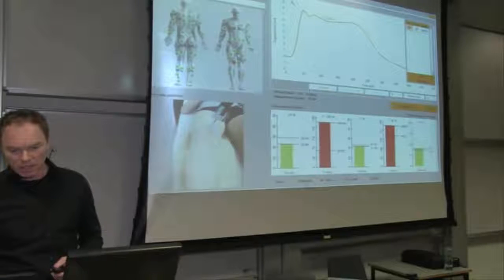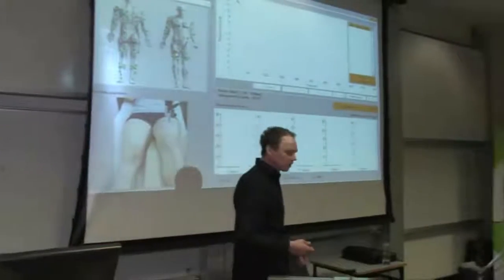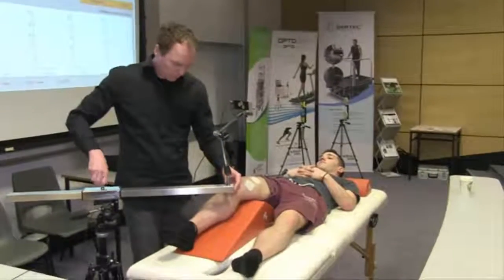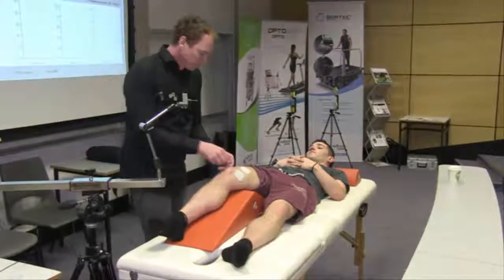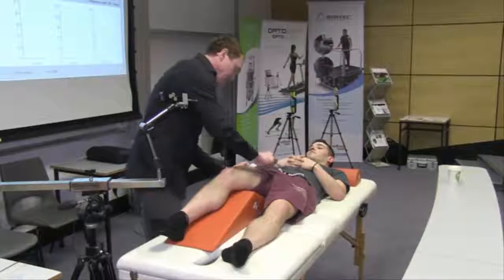So like I said, I'll do the rectus femoris now. And I'll try to do it a bit quicker now so we don't lose too much time. Okay, extend again.